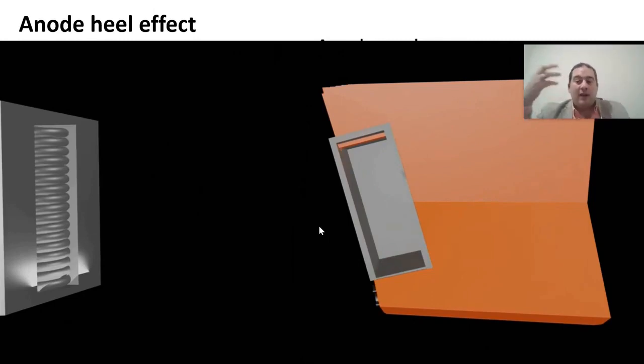But right now, for example, if there aren't enough photons to create interaction, it will create noise in the image. This means that the image you will receive lacks enough interaction between the X-ray photons produced from the anode and the organ itself. That's why you choose a lower thickness to ensure interaction, so that the number of photons interacting with you is suitable for the thickness of that organ.